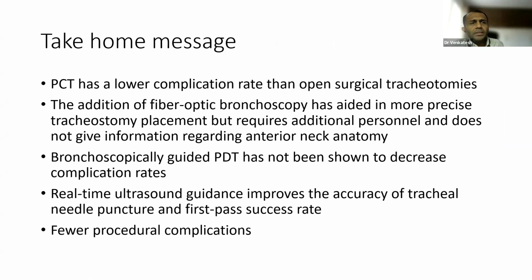So the take-home message is percutaneous tracheostomy has lower complication rate than the open surgical tracheostomies. Addition of fiber optic bronchoscopy has aided in more precise tracheostomy placement, but requires additional personnel. Bronchoscopically guided percutaneous tracheostomy has not been shown to decrease the complication rates. Real-time ultrasound guidance improves the accuracy of tracheal needle puncture and first pass success rate.